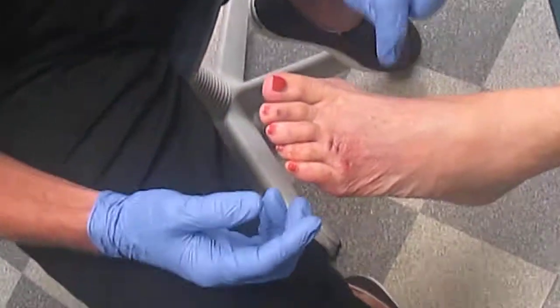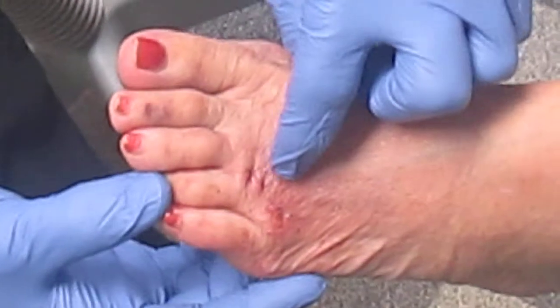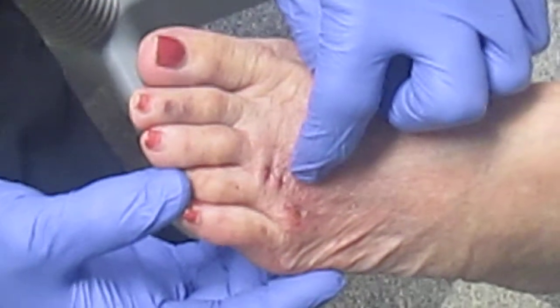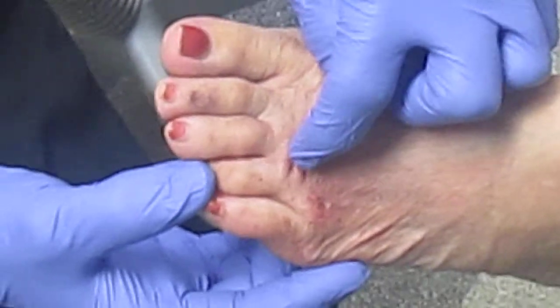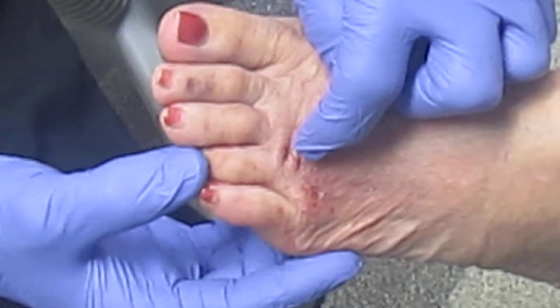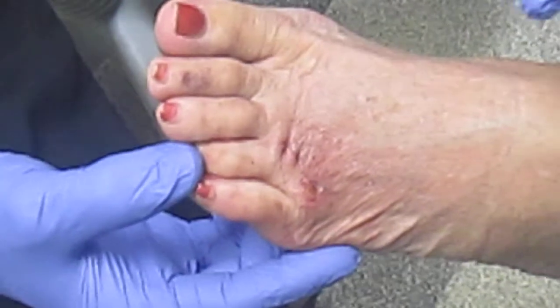Basically, for this procedure what we do is a percutaneous incision dorsally, and through this we follow the third metatarsal from the proximal portion to the end, to the toe, where we transect the intermetatarsal ligament. This decompresses the neuroma.